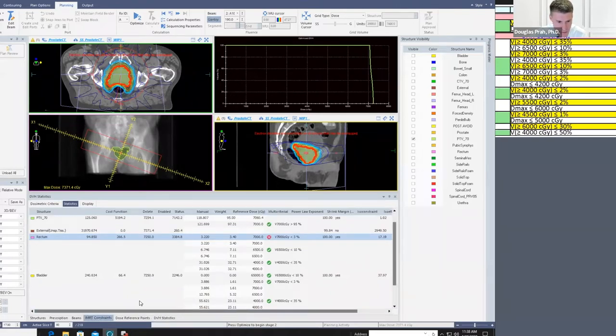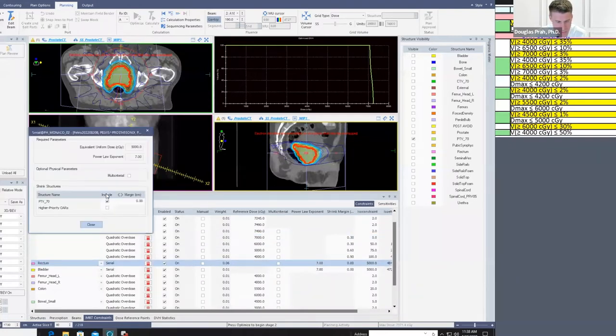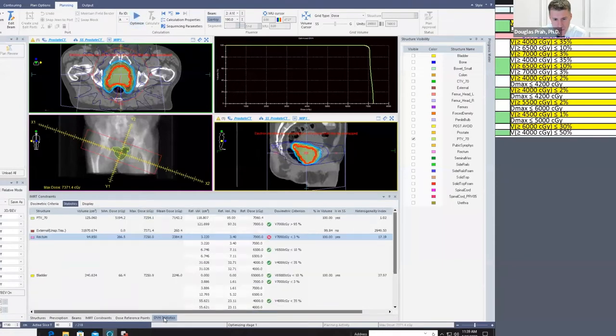So let's make a quick adjustment in real time. You remember I said we can turn this on or off. Well, in this case, since I'm going to have part of the volume that's going to overlap that and I want to control that, I'm just going to turn that off since we're trying to keep that down. It's made some changes already, but here, let's run it through stage one again. And then we'll come back and take a look at the statistics table while that's running. So it's coming down a little bit and voila, it dropped 3% by making that change to the plan.